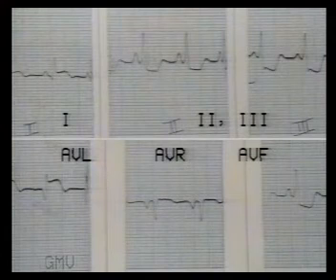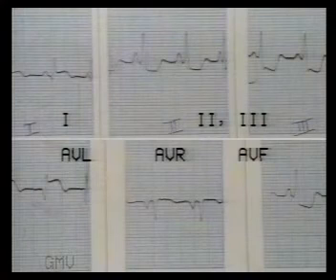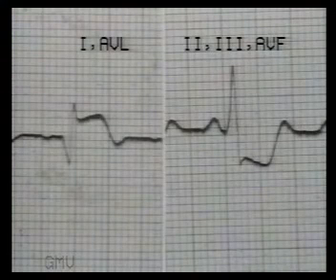The leads 2, 3 and AVF show marked ST segment depression, suggesting an extensive infarct. More the depressions and elevations, more extensive is the infarct. Note in close-up view, ST elevation with Q wave in anterior leads and reciprocal ST depression in inferior wall leads.